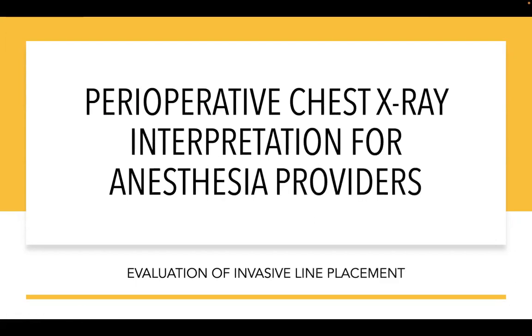Welcome to Perioperative Chest X-ray Interpretation for Anesthesia Providers, Module 3. In this module, we will discuss evaluation of invasive line placement.